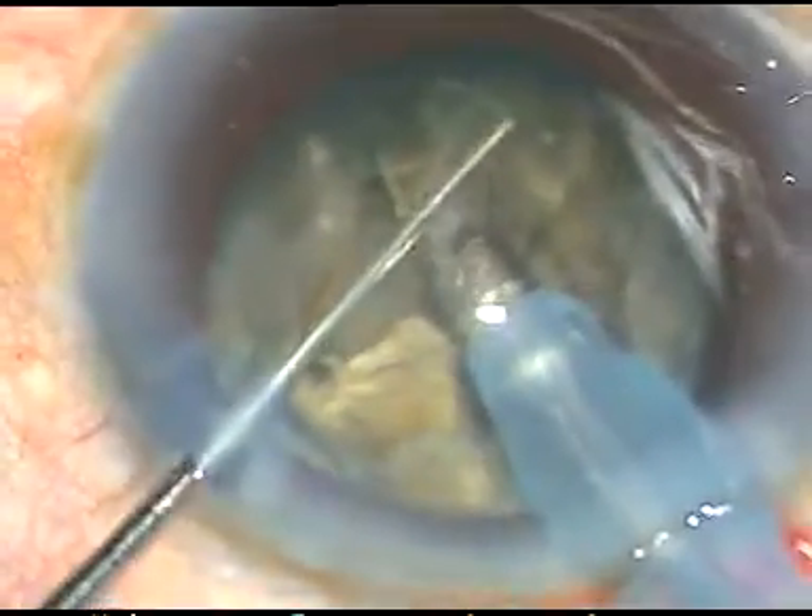The phaco power at this time is 85%. I am in phaco 2 mode. The flow rate is 40 ml per minute and vacuum is 400 mmHg. I have been able to emulsify a portion of the hard nucleus.